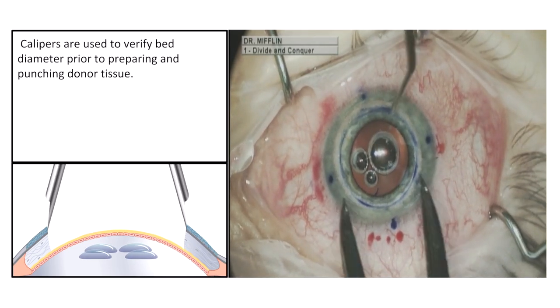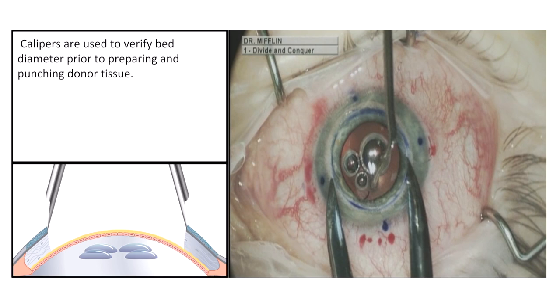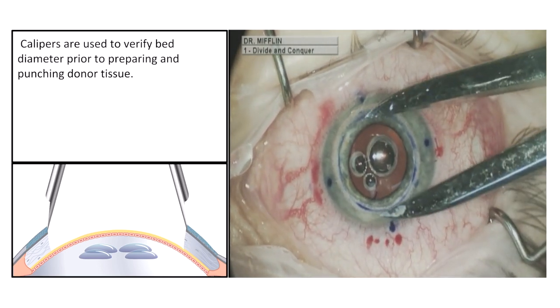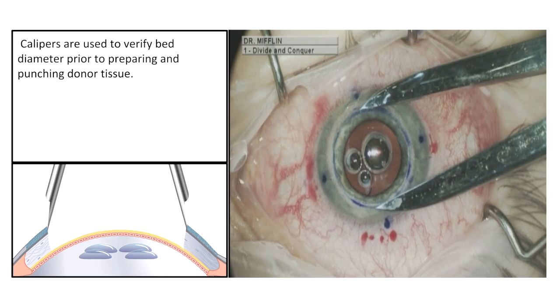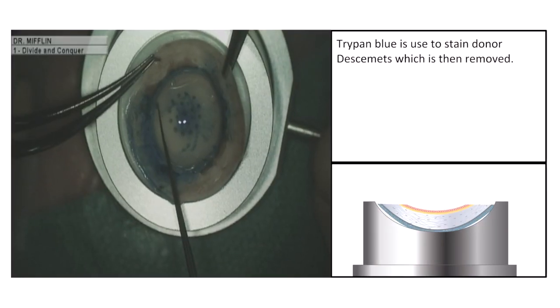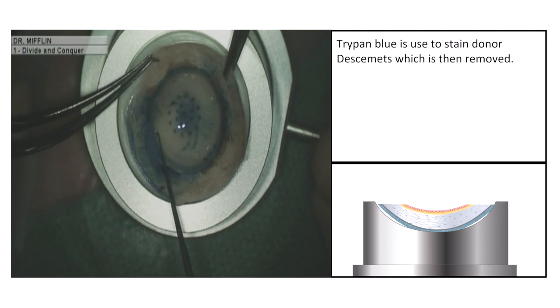Calipers are used to verify bed diameter prior to preparing and punching donor tissue. Now let's shift our attention over to the donor cornea.